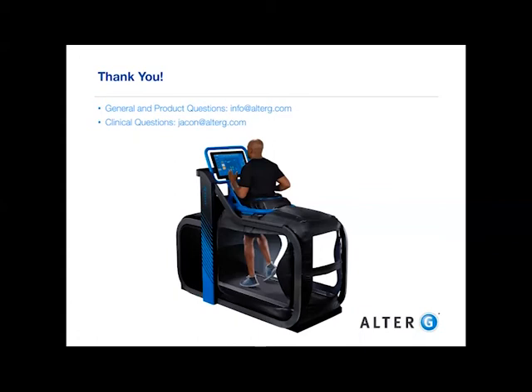Fabulous. What patient population should not use the AlterG? Are there any contraindications? There are a few contraindications that we list. The only three are if they have unstable fractures. Of course, they wouldn't be released for weight bearing anyhow. So anybody with an unstable fracture should not be using the AlterG.